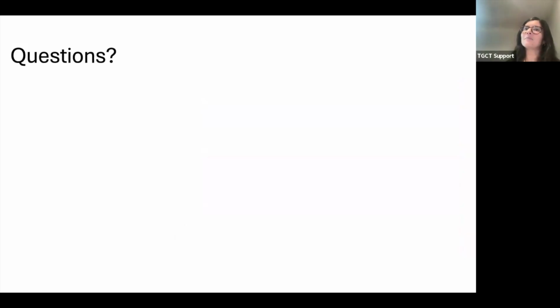All right. So hopefully that wasn't too much histology for you guys, and hopefully it cleared up what we see histologically. But any questions?